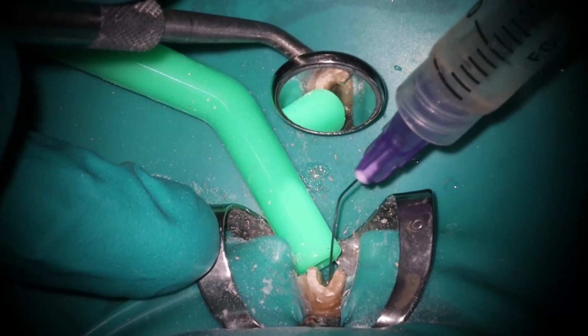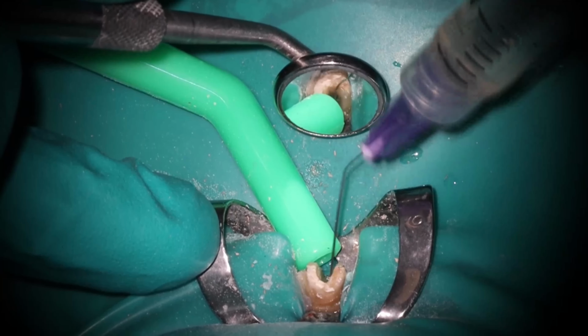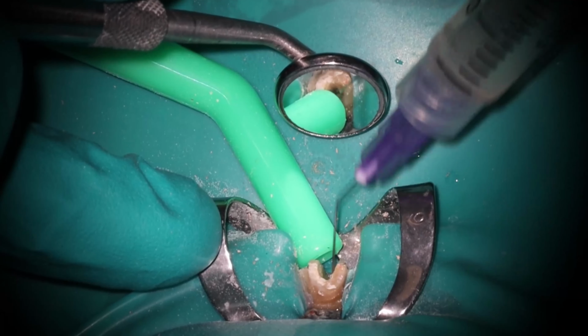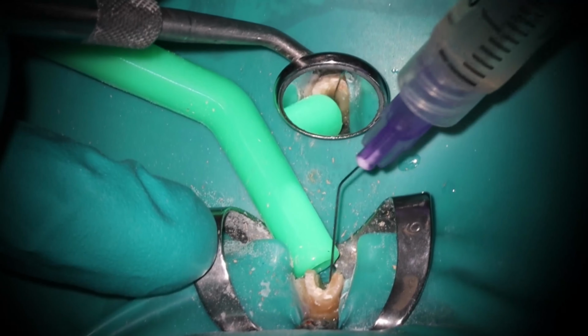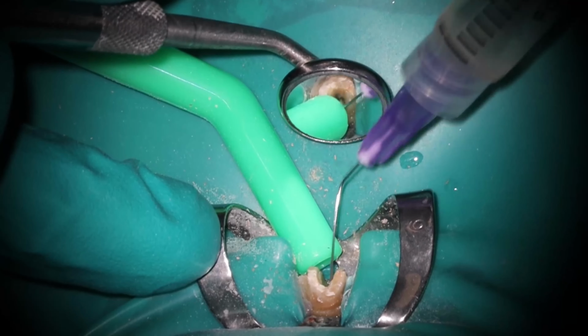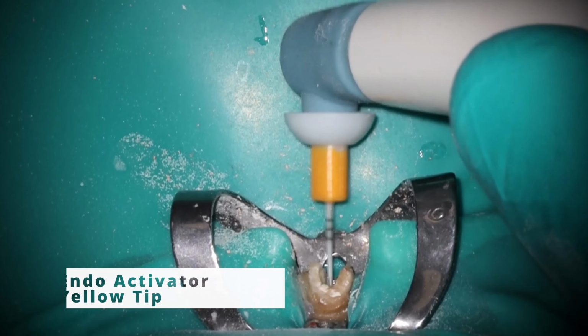On a case like this where you just have that finding, he's never had any pain in this tooth. The root canal was probably 15 years old, but we're going to be putting a post in there anyway, which means if it were to fail, an apico would really be the only option, because I don't like drilling back down through these teeth. You run the risk, especially if you're removing, in this case, a post is for sure necessary to help hold everything in place. And if I remove that post, then we're going to be in a lot of trouble in the future trying to get this thing out.